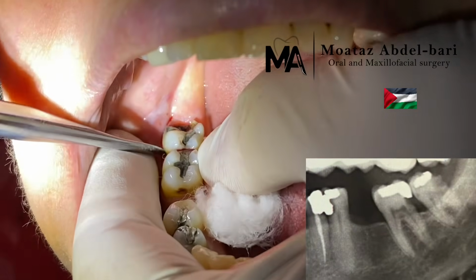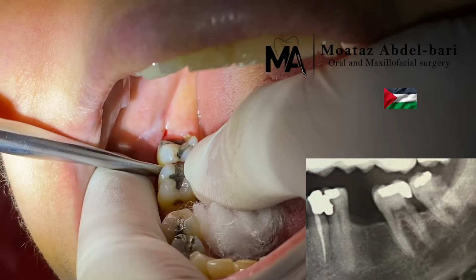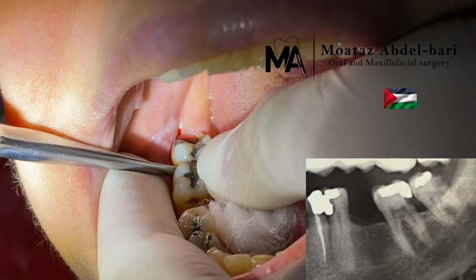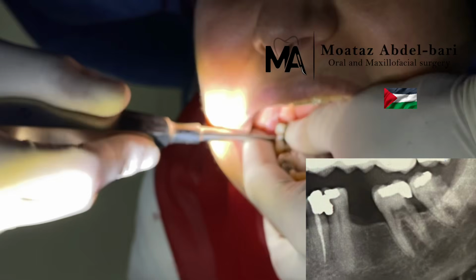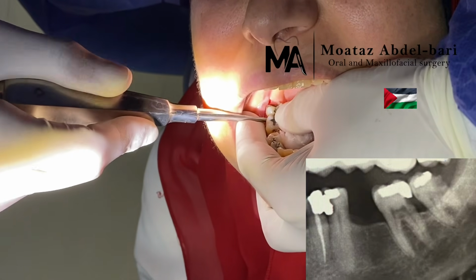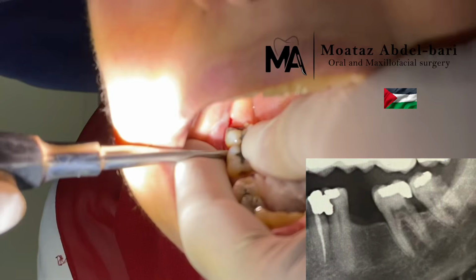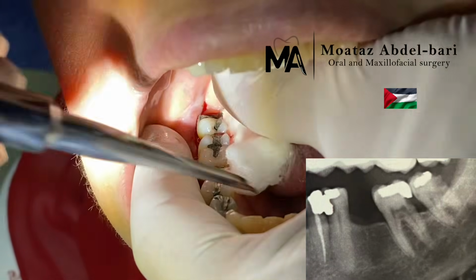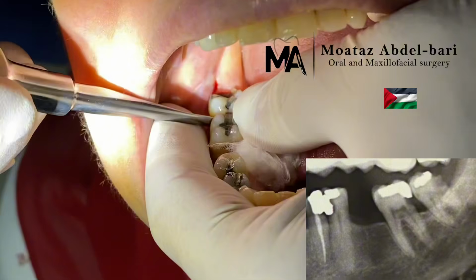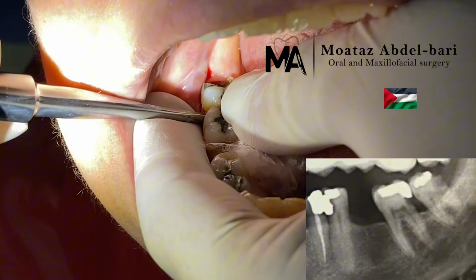Today we are tackling a case of lower right third molar extraction with radiograph. It is very difficult, as you can notice from the radiograph. Number 1, it is restored lower 8 by amalgam restoration, which means it's a functional tooth. Missed lower 6, which means it carries more load than usual. Opposed by upper 8, very difficult.